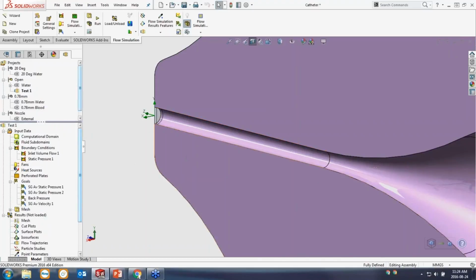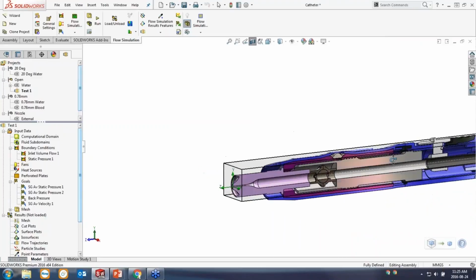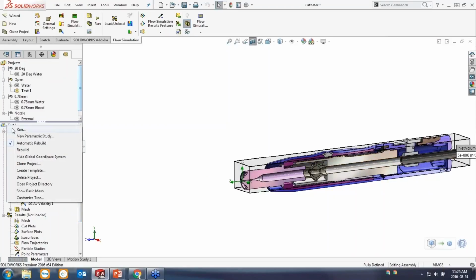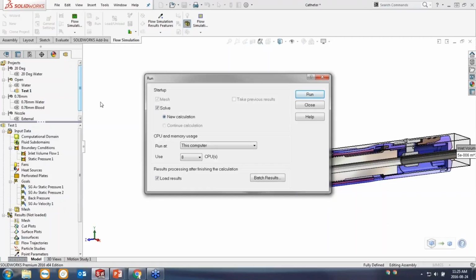So that's really it. We're really ready to run the analysis now. We've got our fluid recognized, we've got our boundary conditions applied, we've got all of our wizard steps run through. I'm going to take that study, I'm going to hit run. We can see that the solver is going to mesh and solve the analysis.